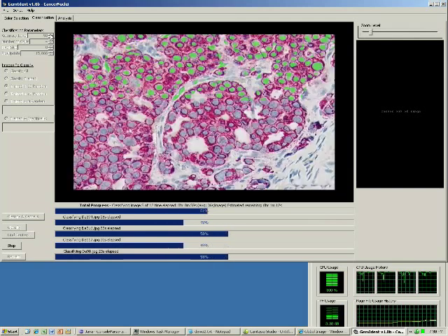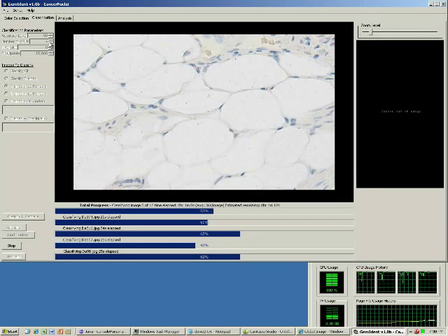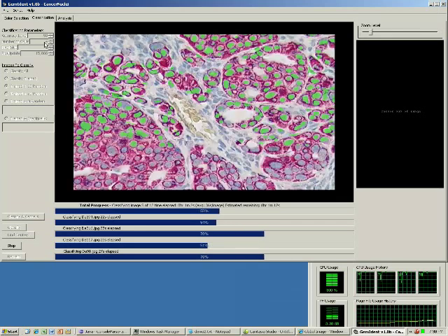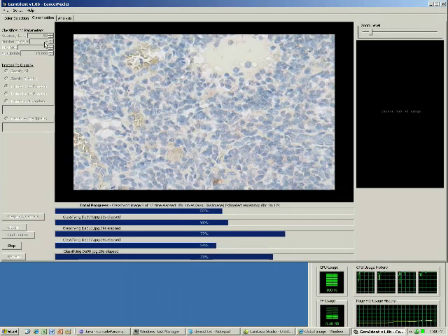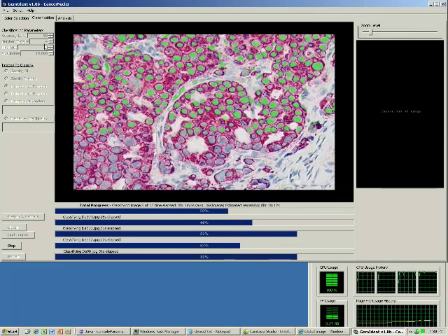The number of CPUs is defaulted to the number of cores the operating system detects. One may wish to use fewer if other applications are demanding.